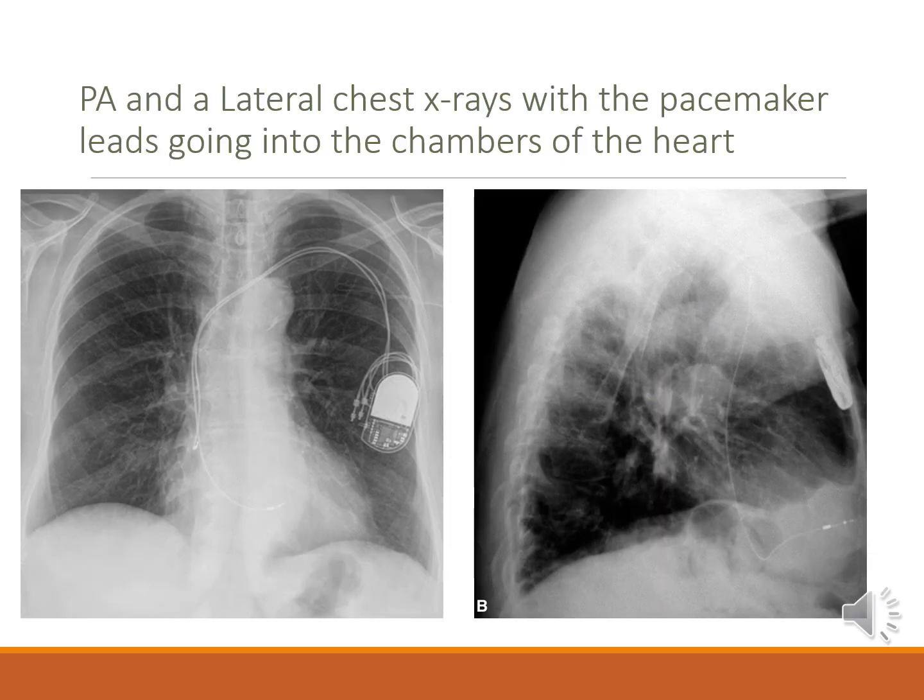Implanted cardiac devices include pacemakers, as shown on this radiographic image, as well as implanted cardioverter defibrillators. Pacemakers regulate irregular heart rhythms with electrical pulses delivered through leads, while newer models may not require leads.